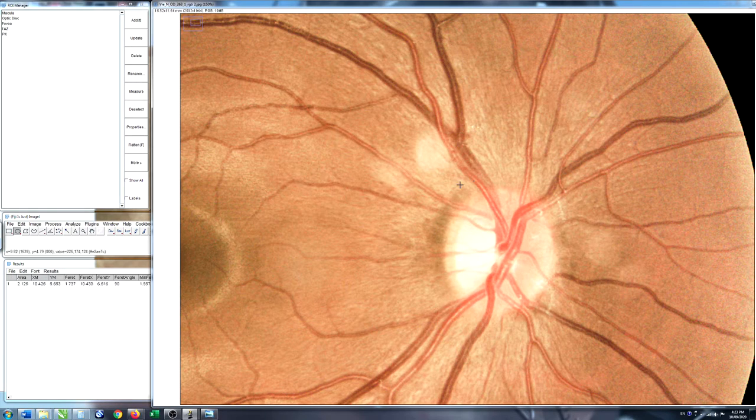Looking back at the optic disc, there are a couple of structures we can differentiate inside here. You can see the rim of the optic disc itself — that's where all the axons from the ganglion cells collect together to form the optic nerve, which then runs back to the optical centers of the brain. In the center there's a slight depression called the optic cup, and between the edge of the optic disc and the edge of the optic cup is called the neuroretinal rim.